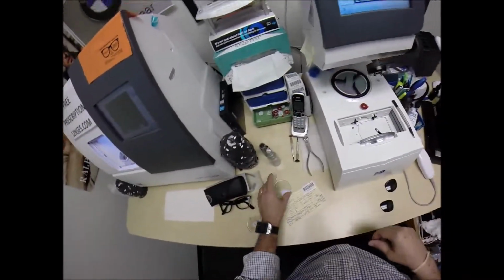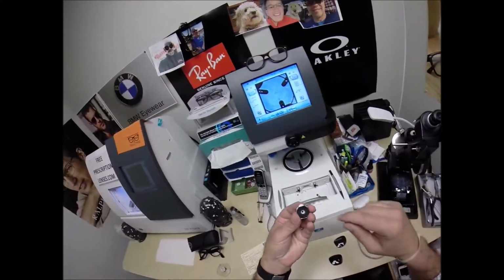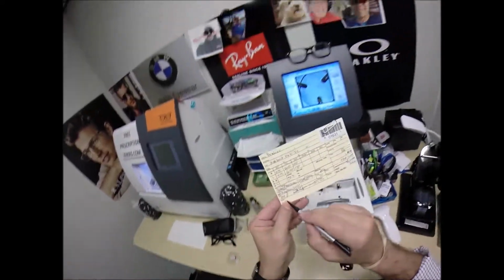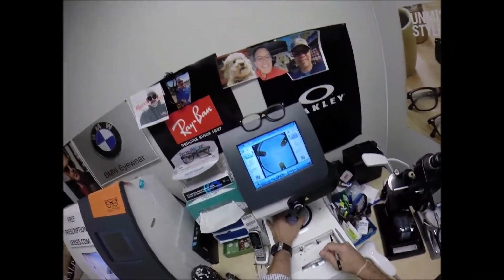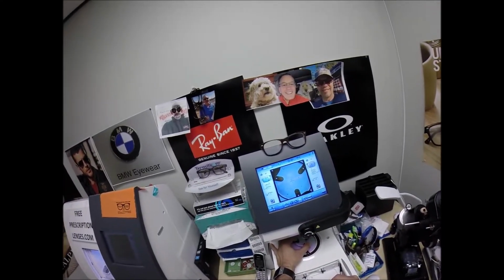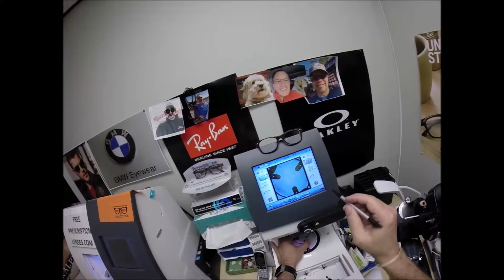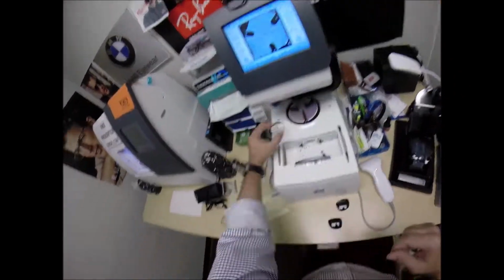We're going to do the same thing now for the lens that ain't right, which I can identify with since I ain't right either. Pull the paper away to make the black side sticky, line up the magnet. Same pupillary distance for the left eye, simply divided 64 in half, which I got as 32. So we're going to line everything up, same pupillary distance, same optical center height, and hit that button.